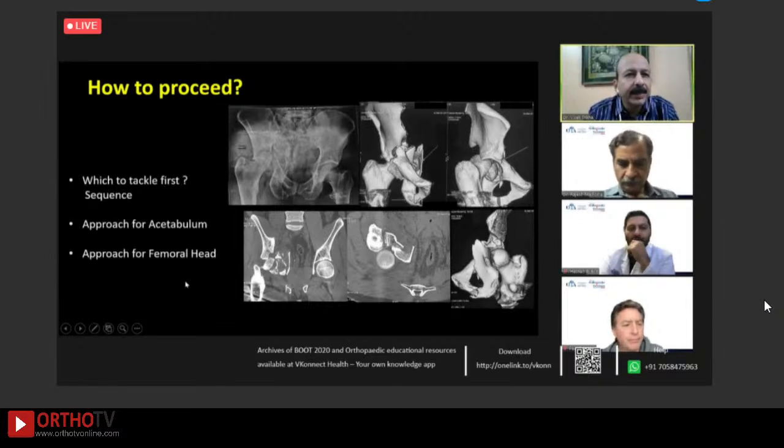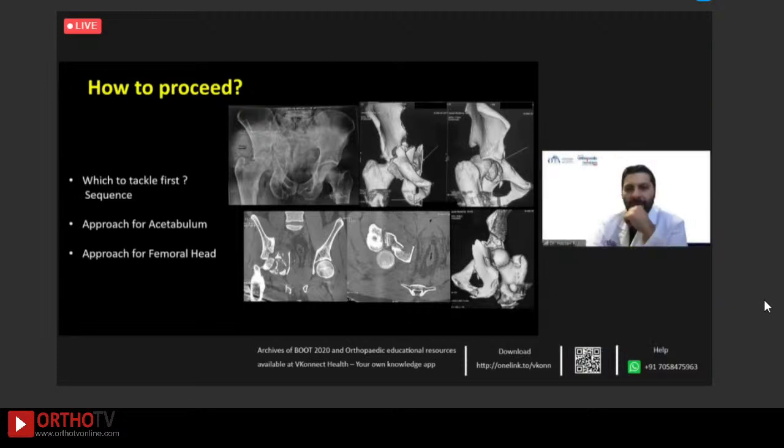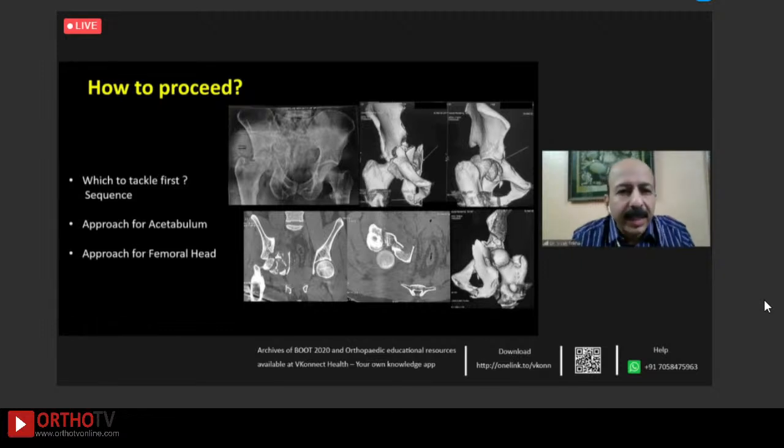Any more comments? No, I think it likely would require the surgical dislocation from the back. And if you're doing that anyway, then I think your anterior column is not going to be that hard to reduce from the back, if you've done the dislocation. Right. So this is what we were discussing, the approach for the acetabulum and the femoral head, which one to tackle first and the sequence.